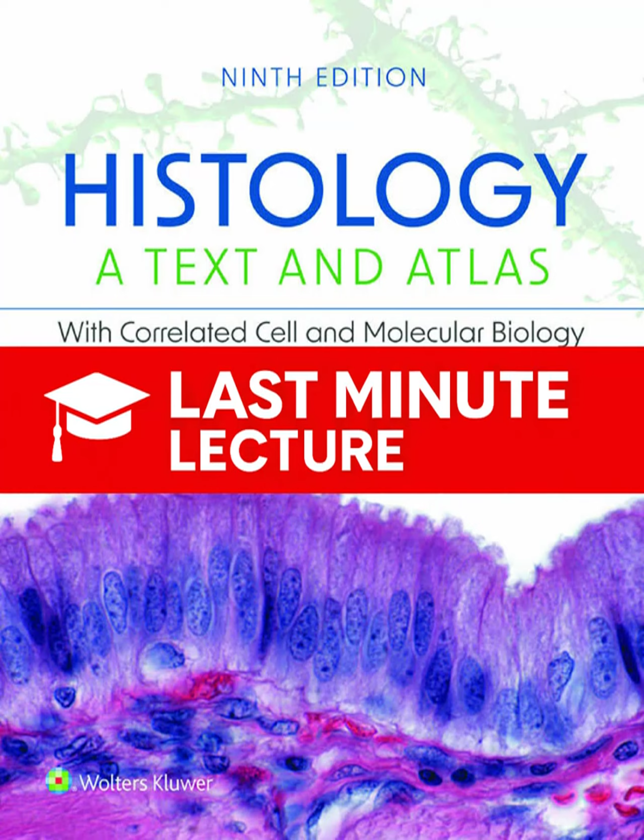And then came the real game changer. Monoclonal antibodies. Monoclonals were revolutionary because they're produced by a single immortalized cell line called a hybridoma. This means every single antibody in the batch recognizes only one specific epitope on the antigen. Which gives you incredible specificity. Unparalleled specificity and standardization. It's essential for both research and diagnostic tests.